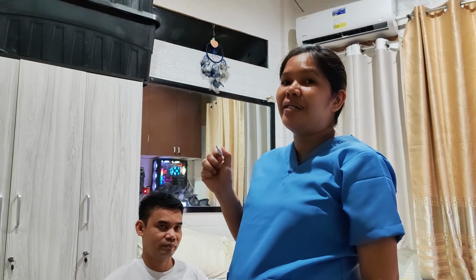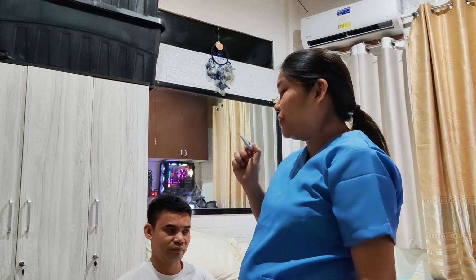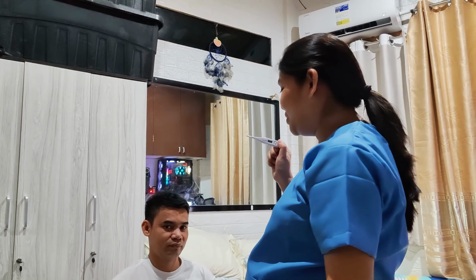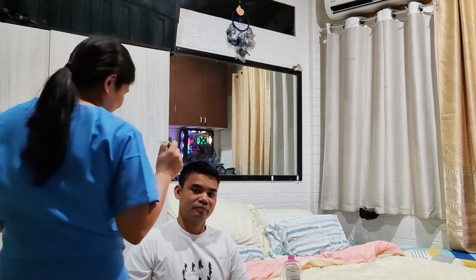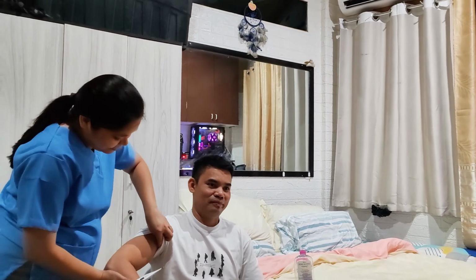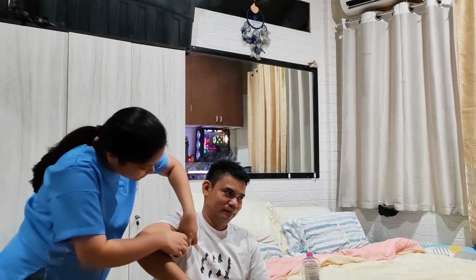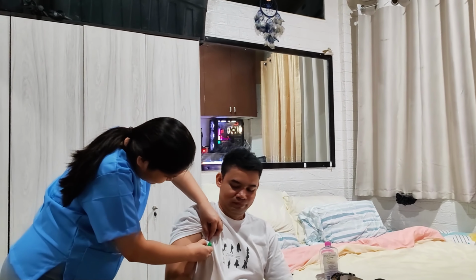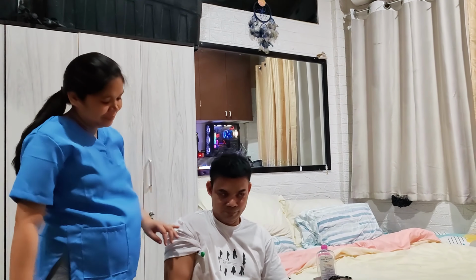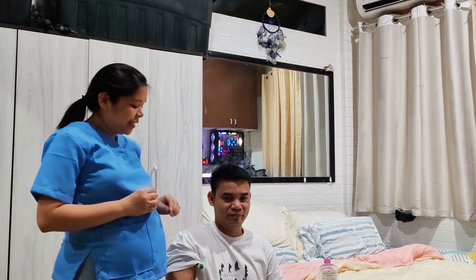Now, I am using an axilla thermometer, so we need to place this under the armpit of the patient. We will wait until the thermometer beeps.